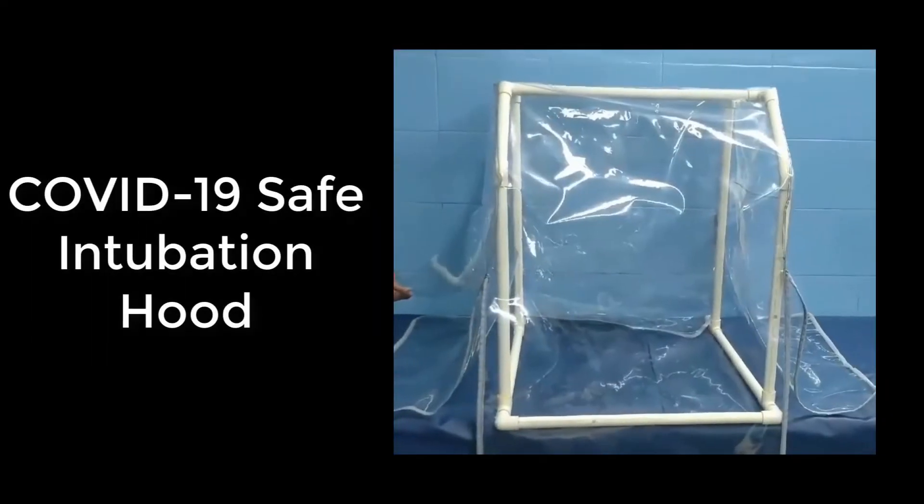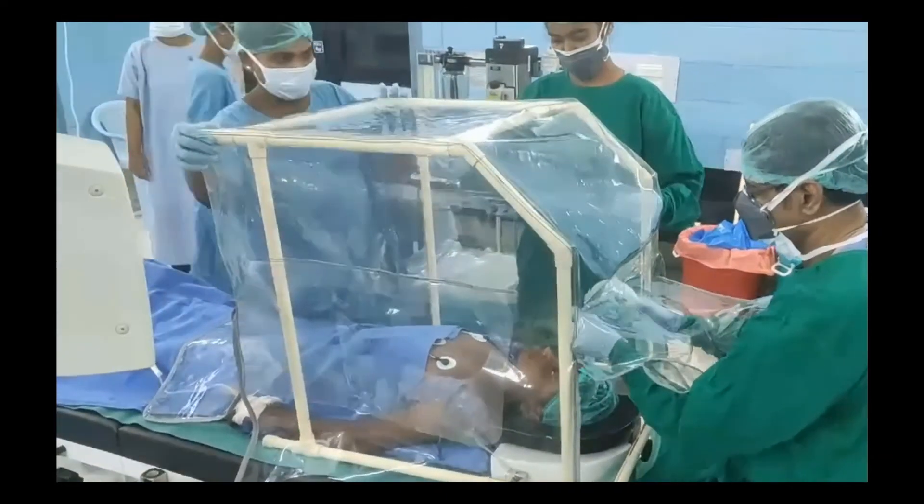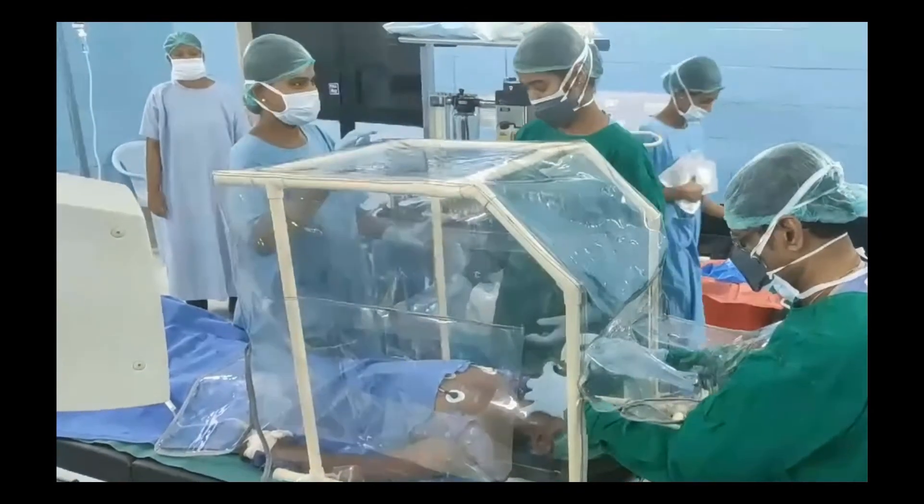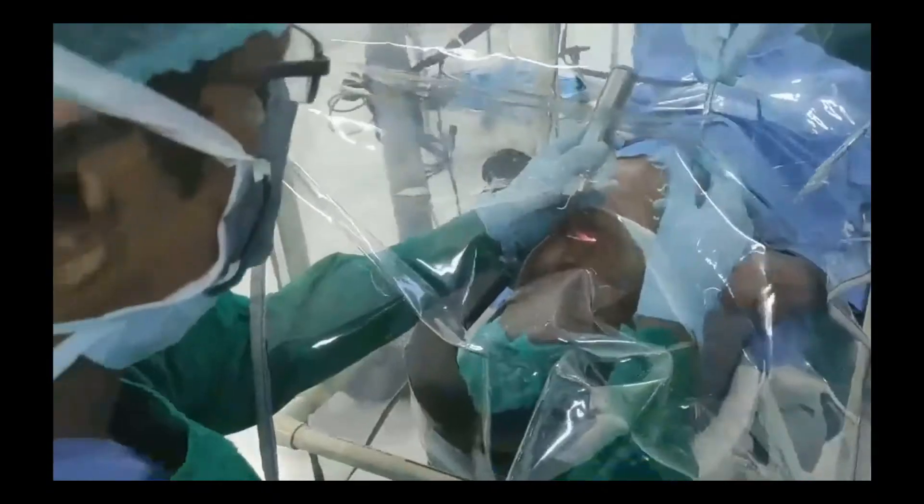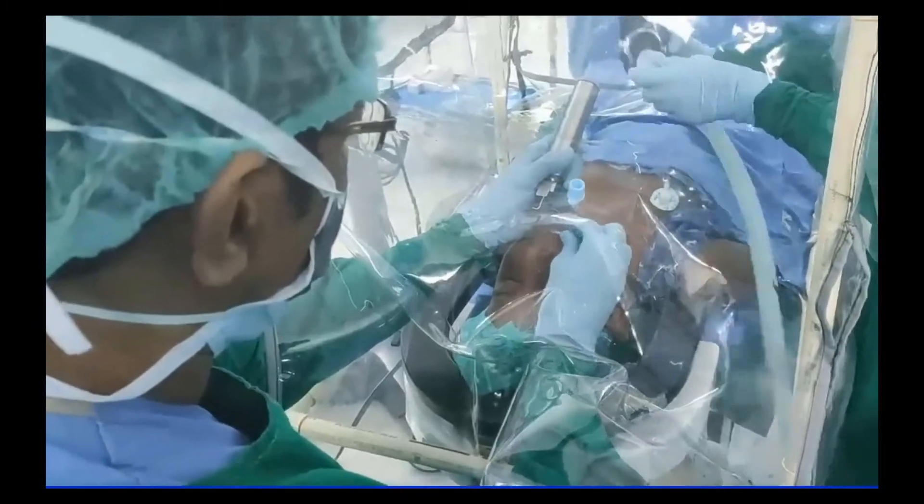COVID-19 Safe Intubation Hood. A simple structure made from PVC pipes and plastic sheets. This intubation hood will minimize the spread of micro droplets and aerosol while intubating and extubating the patient.